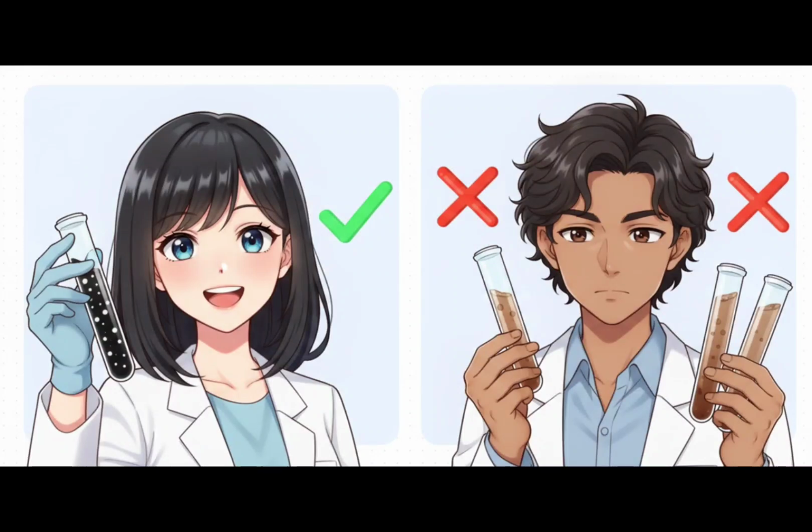A negative result is characterized by a lack of color change. But here's a huge caveat. An organism might grow luxuriantly on the agar because it tolerates bile. But if the agar doesn't turn black, the test is negative. Growth alone absolutely does not equal a positive test. Or obviously, the bile might just inhibit the bacteria entirely, giving you zero growth and a negative test.